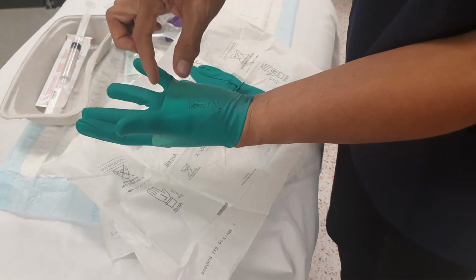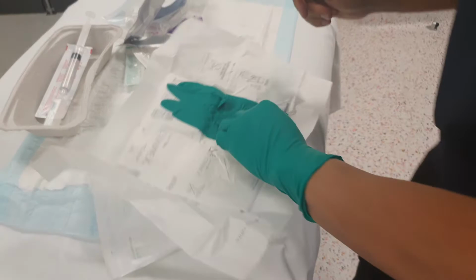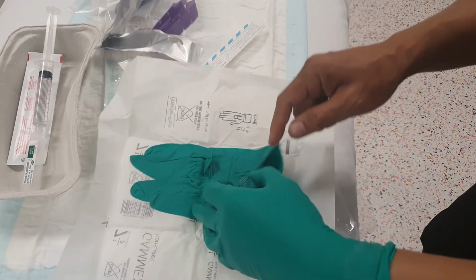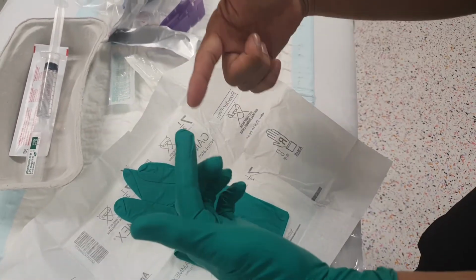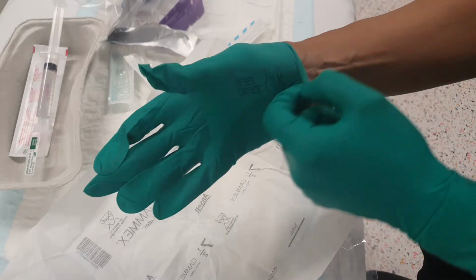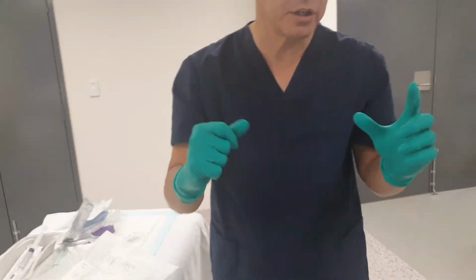Spreading my thumb and finger apart, pulling it down. Don't fiddle with it, okay? This is the dangerous part of the procedure, so you might see us standing up and looking at any contamination, so we don't want to do this. So again, opening this up, spreading apart. Okay, I'm good to go.